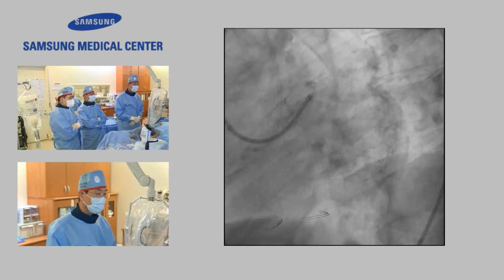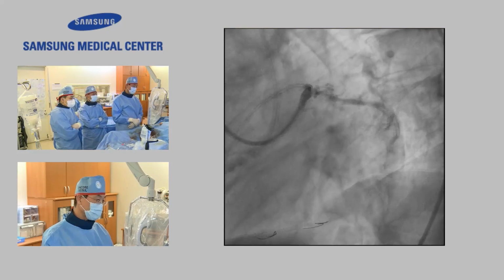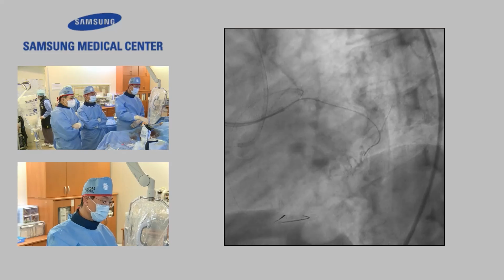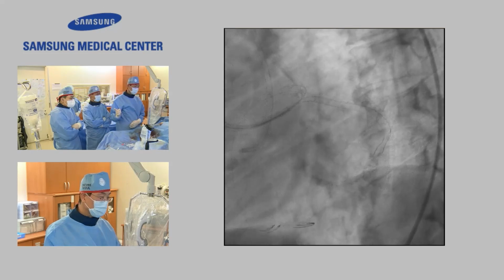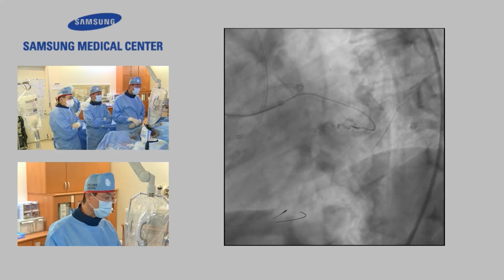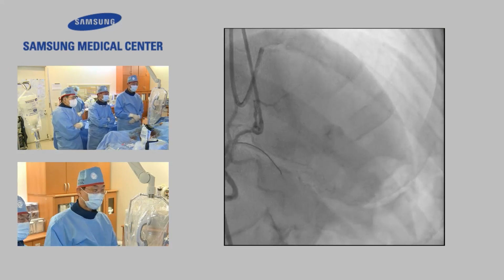We tried to find the collateral. This is a lateral view. Can you tell which branch is supplying the diagonal? It was very, very difficult. So we tried the lowest circumflex obtuse marginal. Not this one. The second one. No. The most proximal one. Actually, this is the early diagonal, so we should try the first obtuse marginal first, as you recommended. Anyway, collateral.